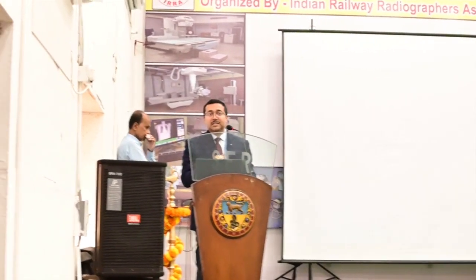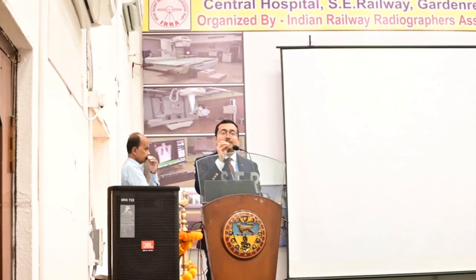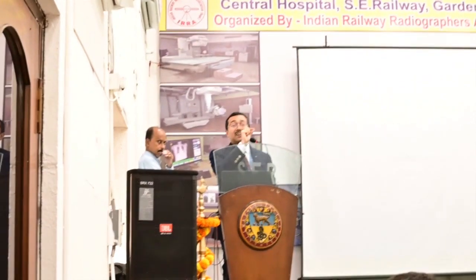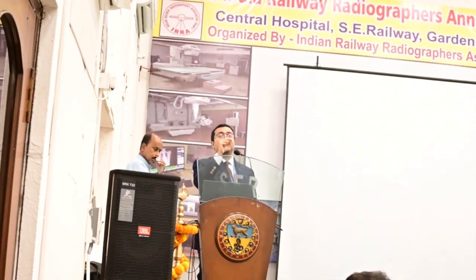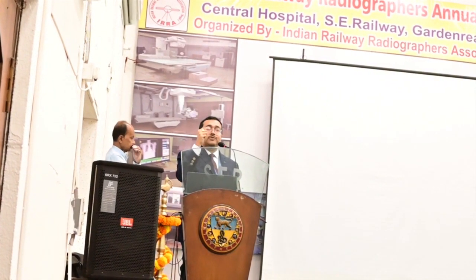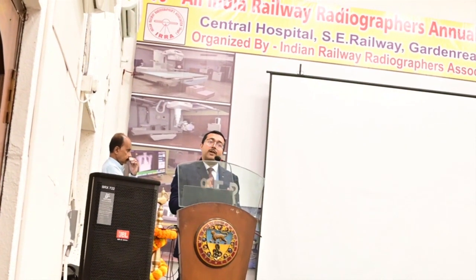No, the pathology is not clearly understood till now. This is actually an aseptic generation of the gas. We see it as a very common finding in day-to-day practice of advanced degenerative changes. It is postulated that due to the degeneration, there is some aseptic gas production in between the two vertebrae, and gas will appear as a dark line in your X-ray. If you see a strip of air within the intervertebral disc, that is known as the vacuum phenomenon.